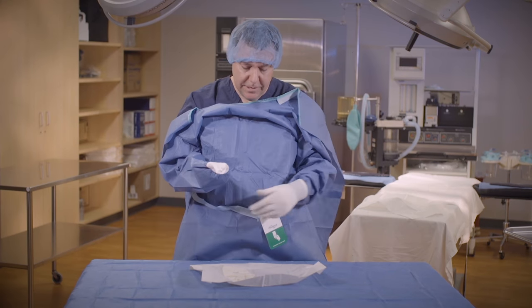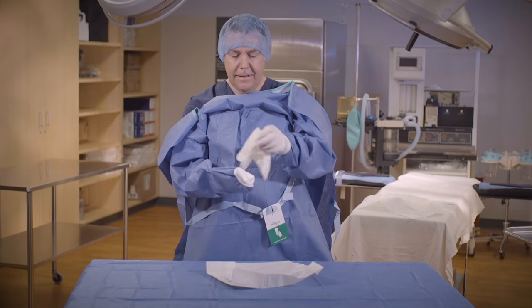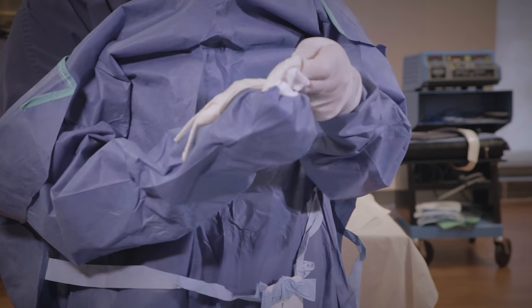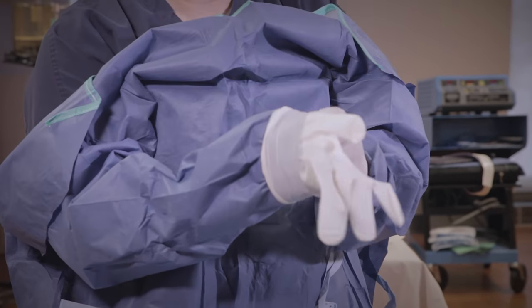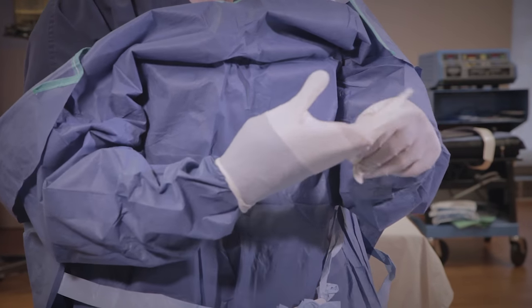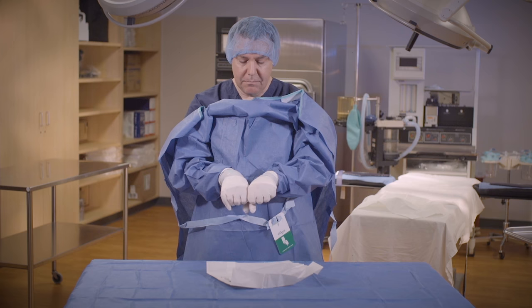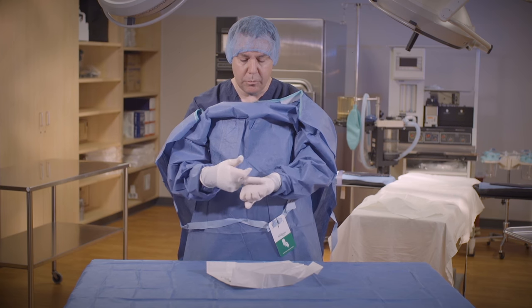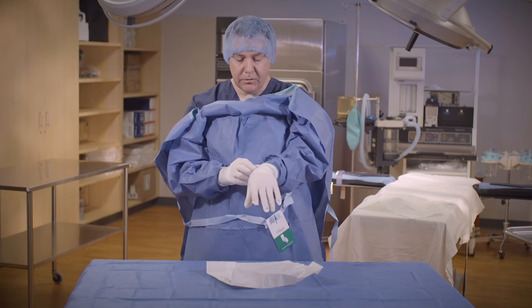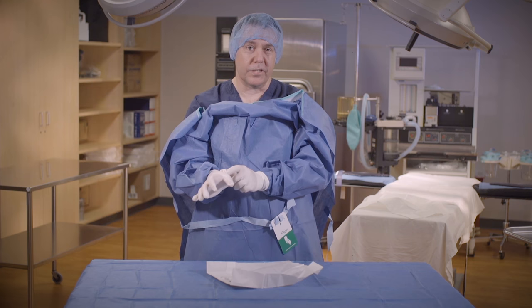I'm going to repeat these steps for the other glove. I'm going to grab the right glove, making sure that the thumb of the glove touches the thumb of my hand. Fingers are pointing up the sleeve, grasping with my thumb and my index finger and extending over the cuff. When I get to this area, pulling on my gown — I can touch the glove — making sure that all my fingers are inside the holes and then extend the glove onto my hands. I like my cuffs along the ridge of the knuckles. This helps prevent contamination. If we get too far back, the gloves tend to ride up and we'll be able to see the white of the cuff. If they are on the knuckle, it's very difficult for contamination to occur.